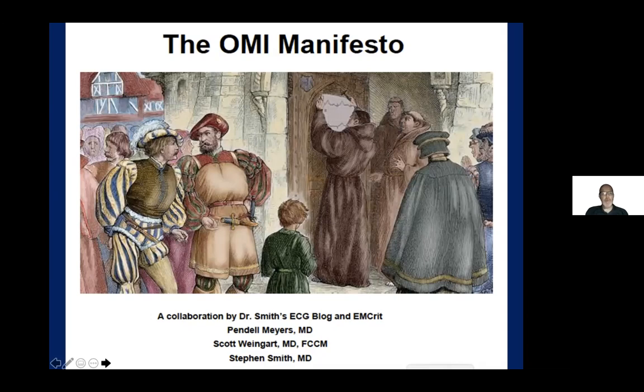Then in 2000, the terms STEMI and NSTEMI came along: ST elevation myocardial infarction and non-ST elevation myocardial infarction. That's kind of where we're at right now, but the times are changing, and we may not be hearing that as much anymore. If you're in the Twitter sphere and you follow Dr. Smith, he doesn't use those terms, he uses OMI, and I'll explain.